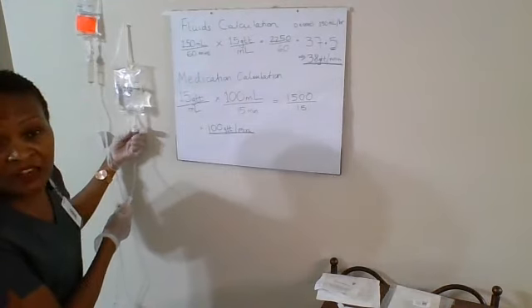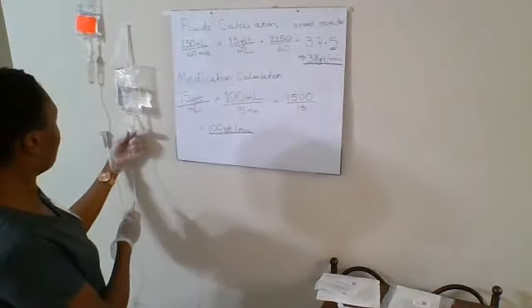And there we go. I have my 38 drops per minute counted.